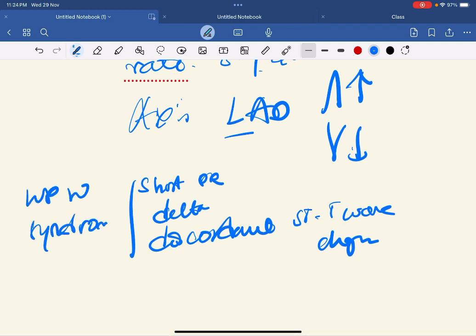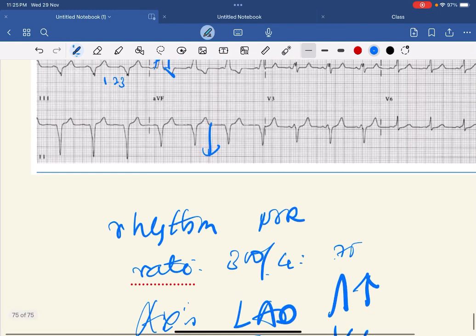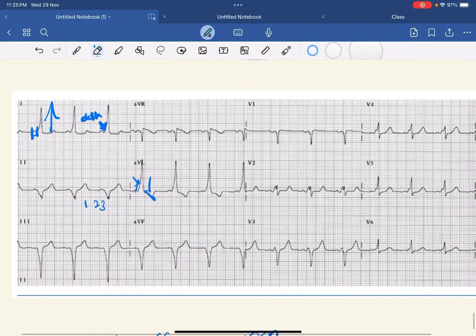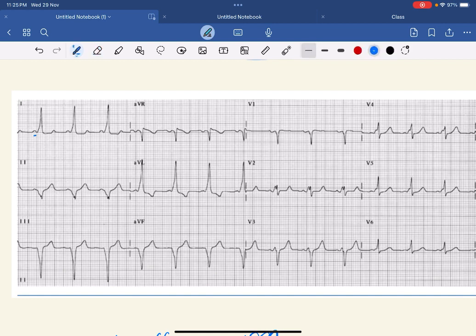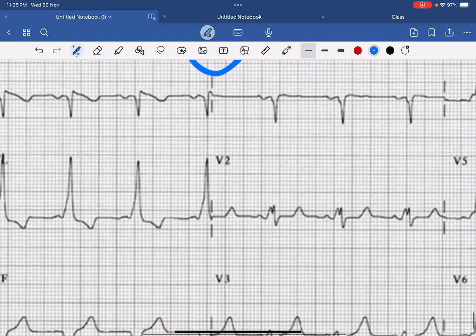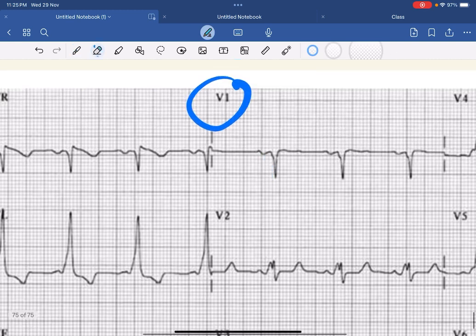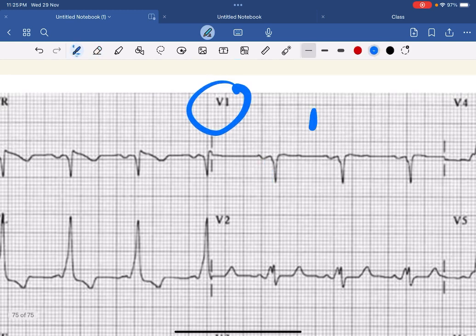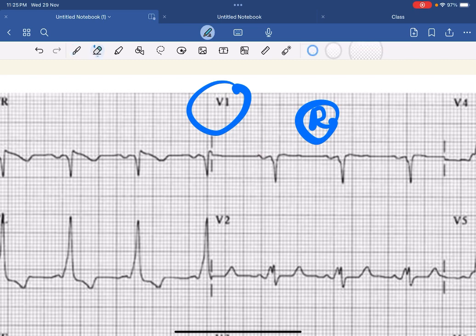Once you diagnose it as WPW syndrome, you have to localize the bypass tract — whether it is on the right side or left side. For that you have to see lead V1. In lead V1, the delta wave is negative. Negative means the bypass tract is located on the right side; if it were positive, it would have been on the left side.